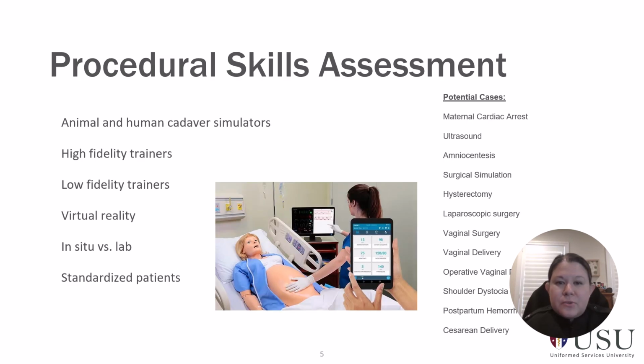In terms of procedural skills assessment, there are many different options shown on the left and many potential cases, particularly in obstetrics and gynecology. Some of the different simulators that are available include animal and human cadaver simulators.